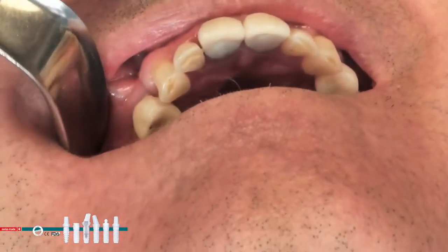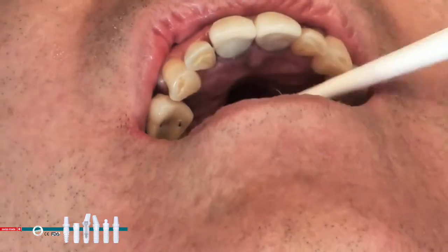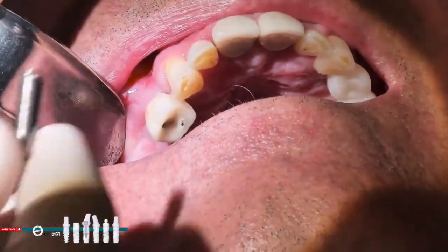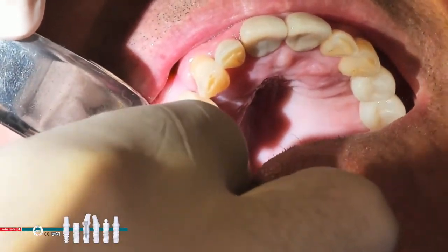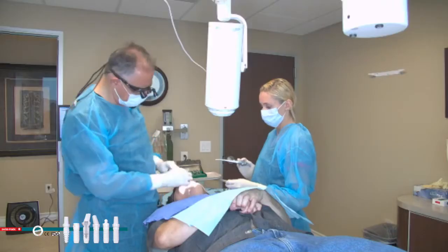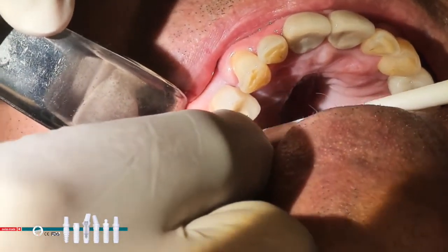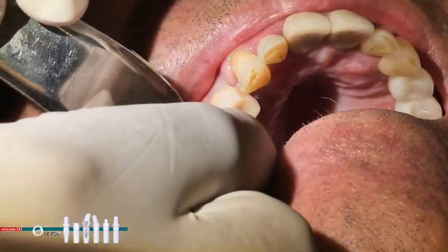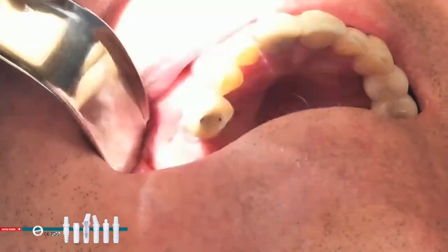Typically, I do 1 or 2 implants freehand. I don't use guides. You can, especially for the beginners. It's a good idea to use guides. But for experienced people, they can do their surgeries freehand. So I can use one of the delivery instruments just to create a little mark to see where I want to place my implant, and have a little projection so you get a little image of the crown and how it will be projected occlusally, and that helps.